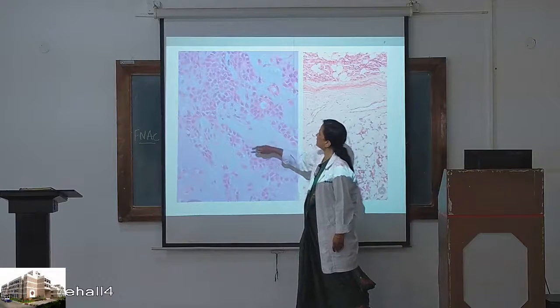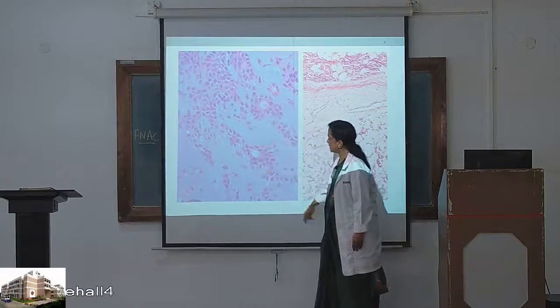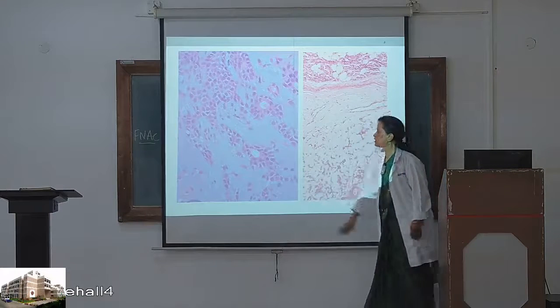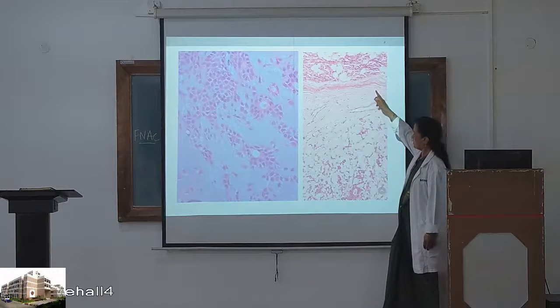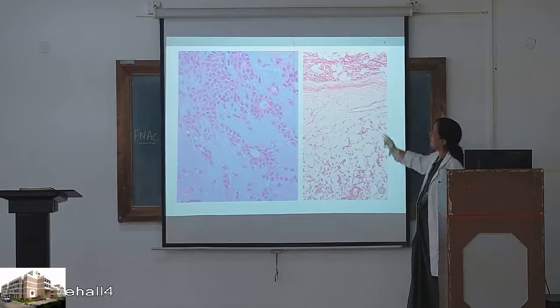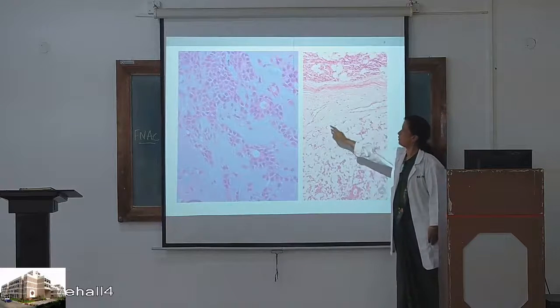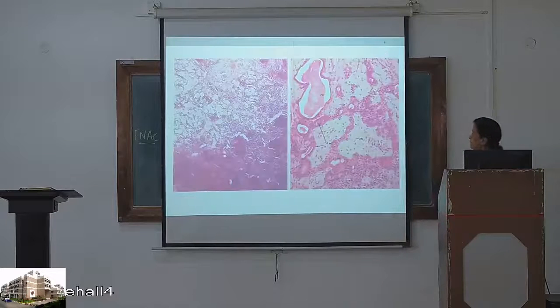These are the myoepithelial cells. Some of the myoepithelial cells are very nicely seen as spindle-shaped cells. So the myxoid stroma is a loosely cellular stroma, and there is the normal salivary gland. That's a parotid. You can see the duct-like arrangement and the myxoid stroma. All these spindle-shaped cells are the myoepithelial cells.